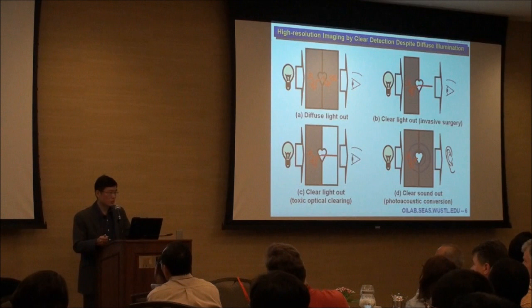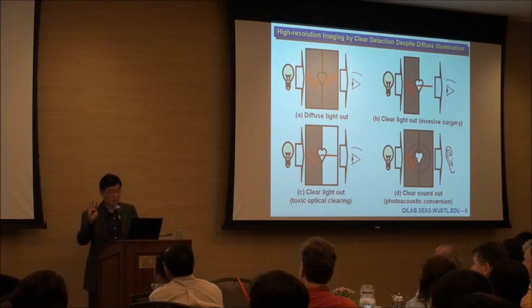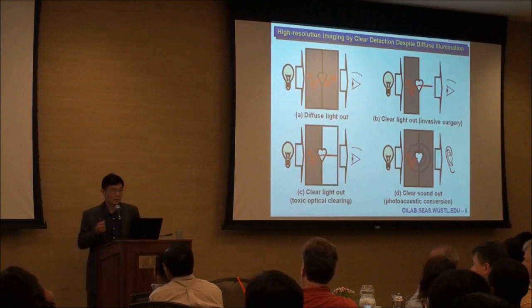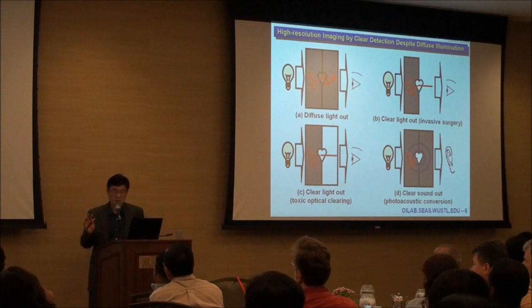And you may ask, why do we bother with light? Well, the reason is that we want to have access to all these wonderful contrast mechanisms provided by light. Why don't we use ultrasound alone? If you use ultrasound, you can only access the mechanical properties. Right? So you have no access to the optical properties I just mentioned. So that's why we need a combination of light and sound into a single modality.